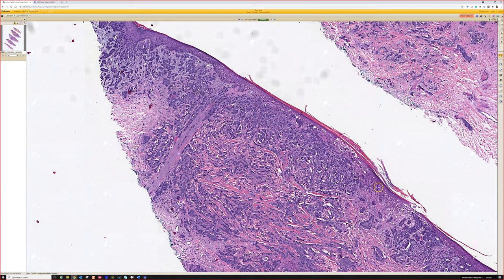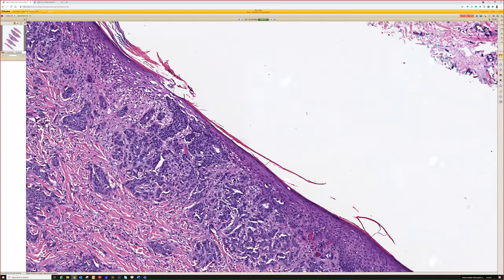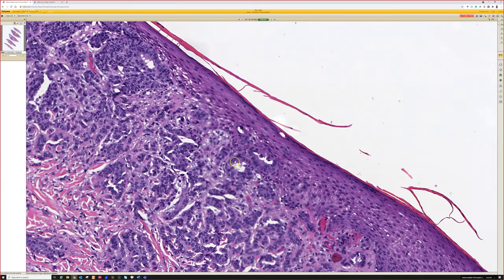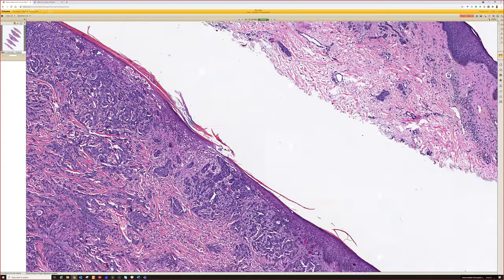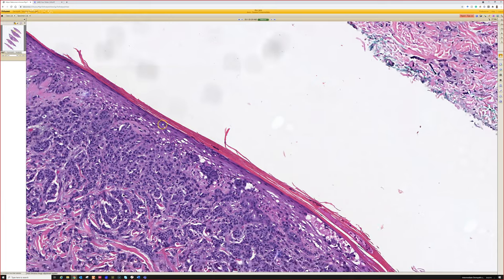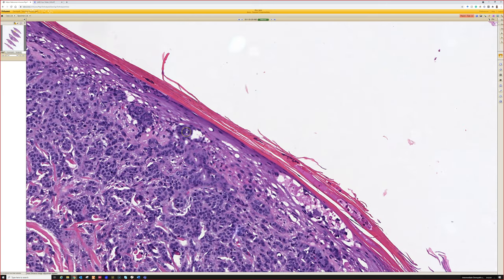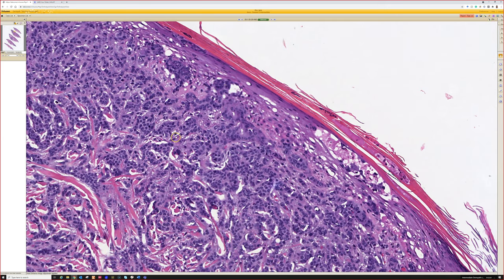And in this case, it's a little challenging because we normally think of metastatic carcinomas as being in the dermis, but look at this. Here we do have some gland formation, and we have them getting into the epidermis. There's an area that was even better than this. Like here. There are actually tumor cells in the epidermis. Normally, when we see that, we think of a primary from the skin. But there are exceptions. Just like when melanoma metastasizes, it can grow back up from the dermis into the epidermis, and we call that epidermotropic metastasis.